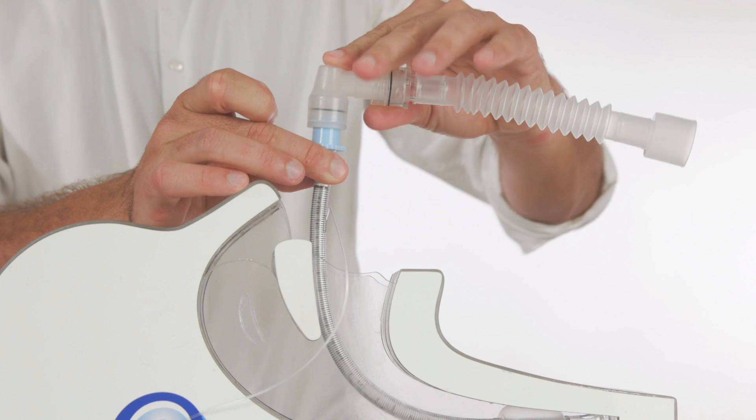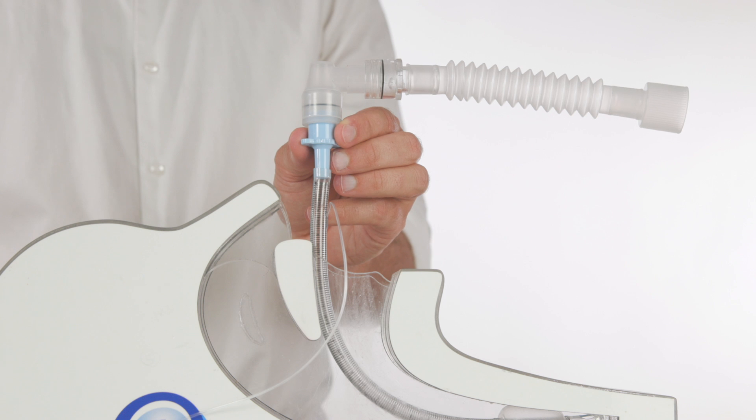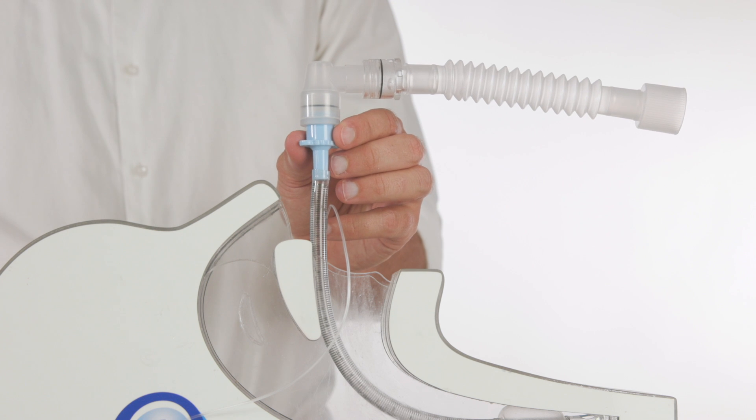The airway tubing extension is removed from the top of the LMA. We have now converted from an LMA to an ETT with limited interruption to ventilation using the Genesis Rescue endotracheal tube.